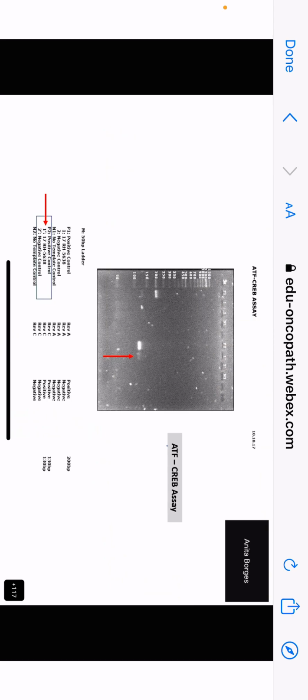Okay, so this is an epithelioid. I'm sorry, this is not an epithelioid hemangioma or hemangioendothelioma. This is an angiomatoid, and it is called angiomatoid because it resembles some kind of angioma-like thing, but it is not of vascular endothelial origin. Okay, and we can go and read about what it is.